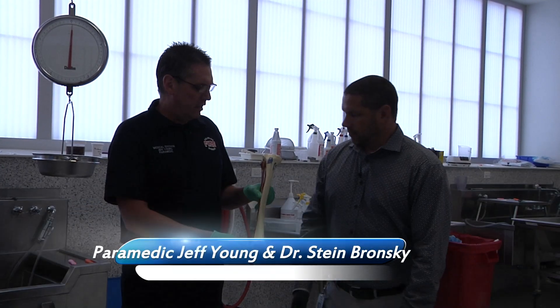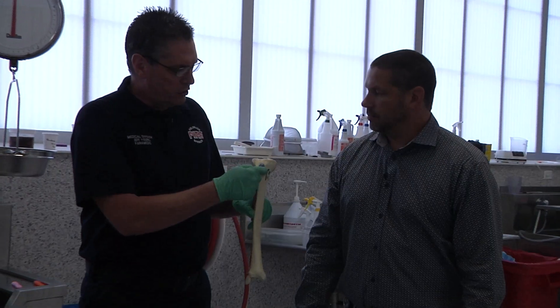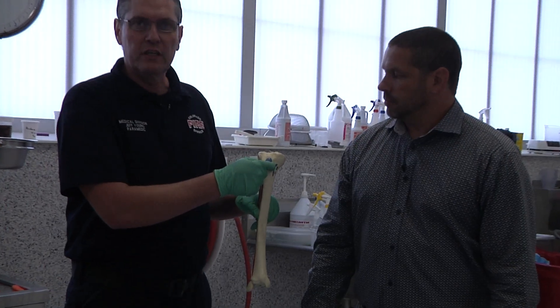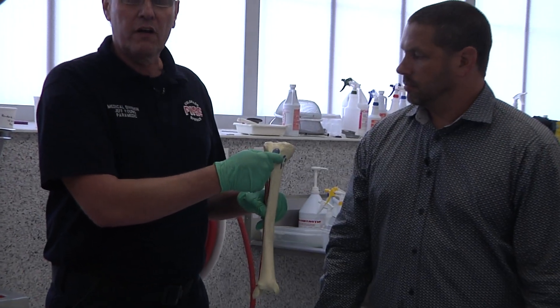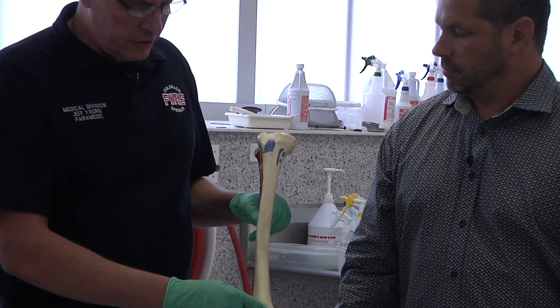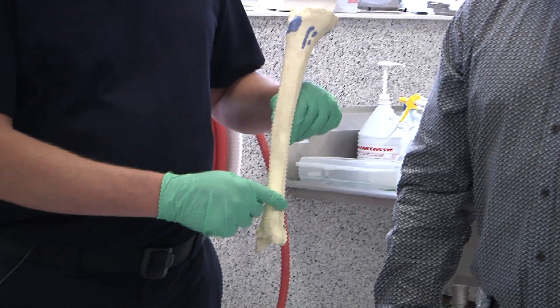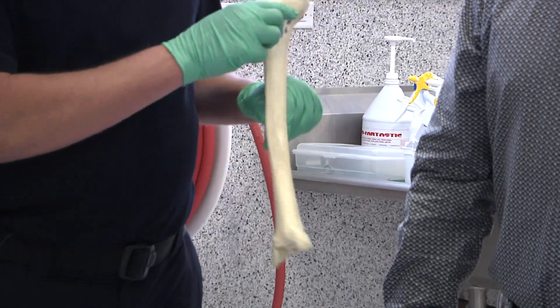Here is the right leg, the right tibia. This is our spot of insertion for a proximal tibia, and this is going to be our point of insertion for a distal tibia. We'll start here.